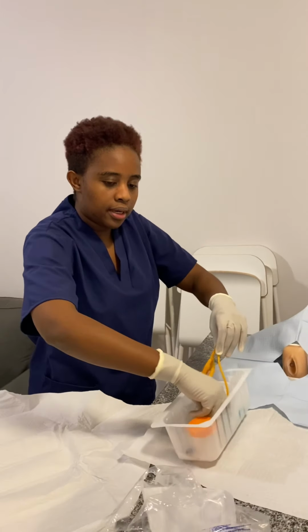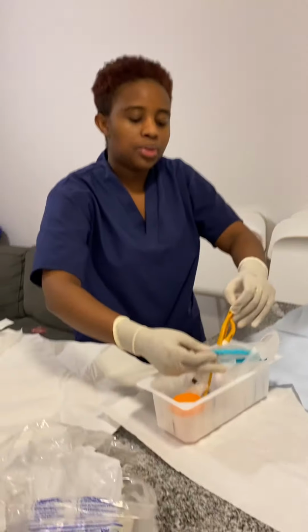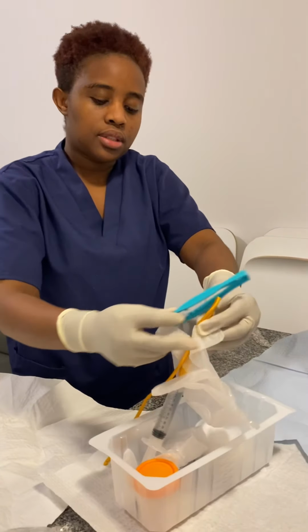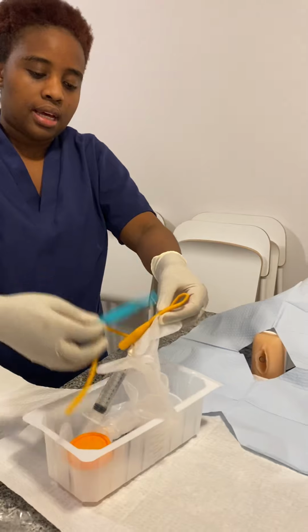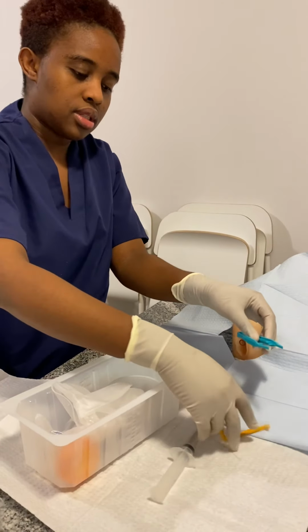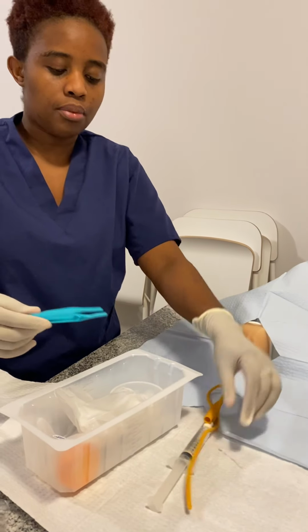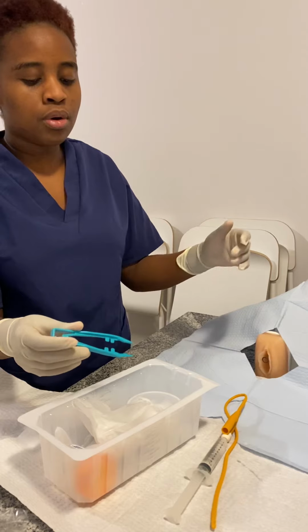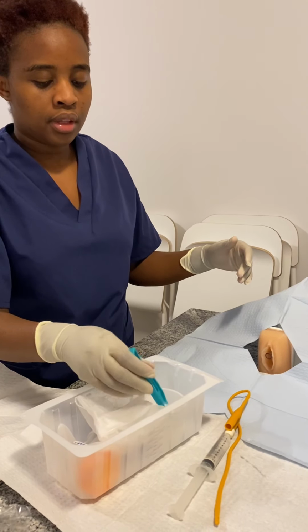And then now I'm going to cleanse the labia. I'm going to do it 3 ways. So I'm going to start distal, proximal, and then in the middle.